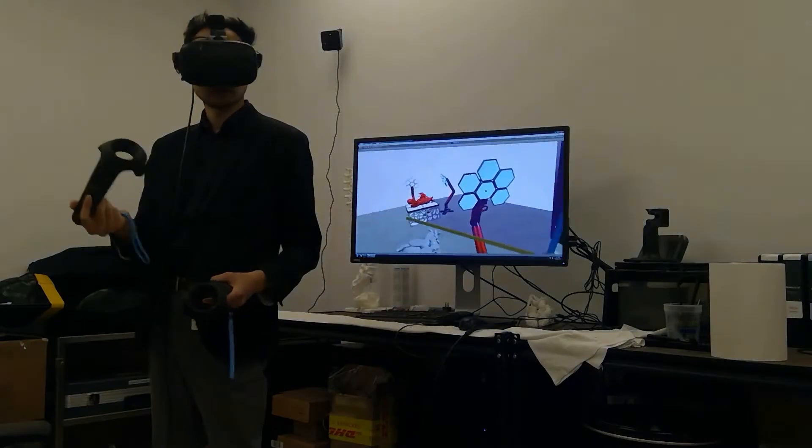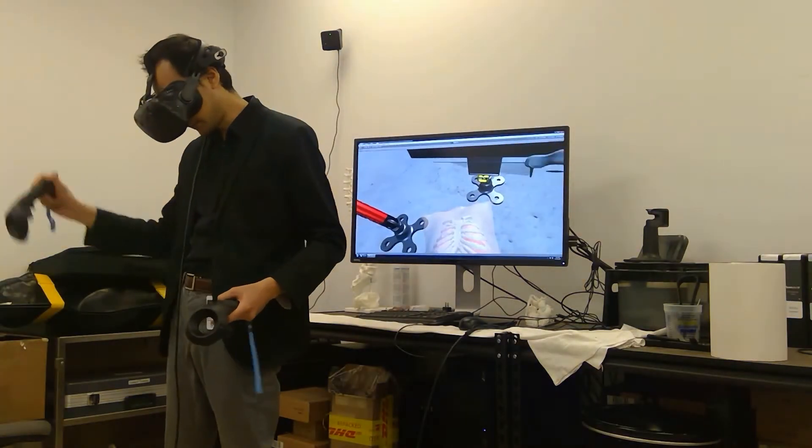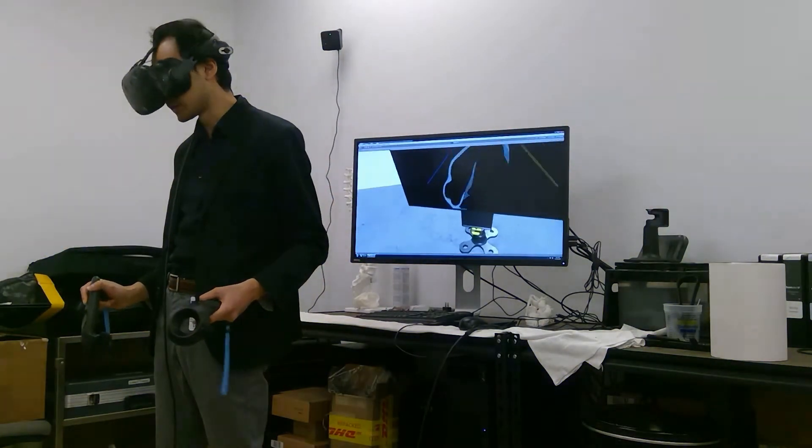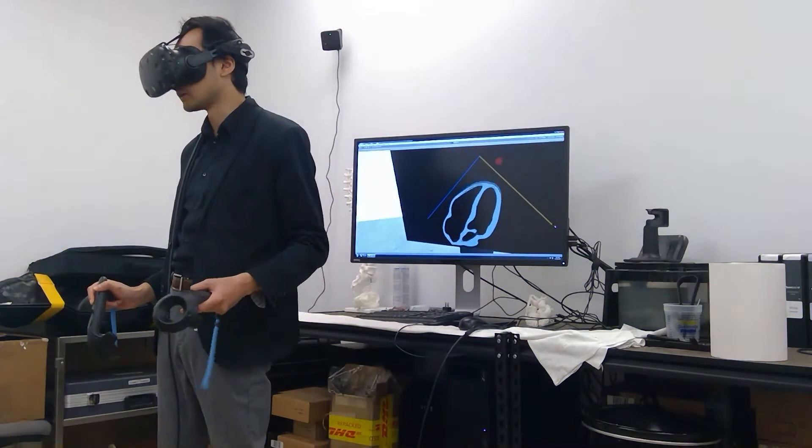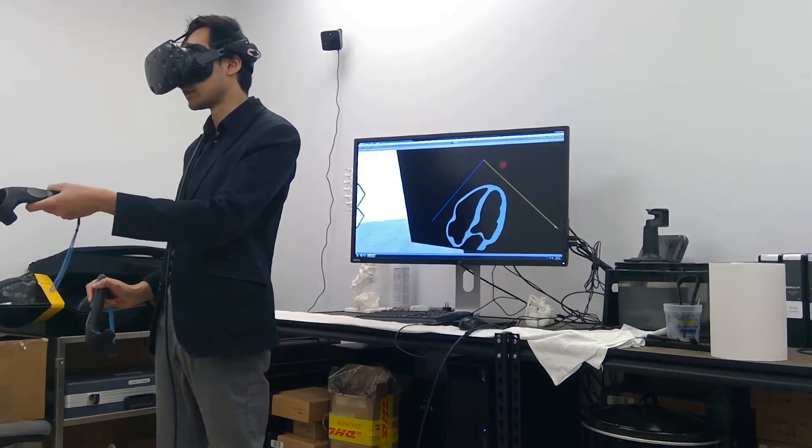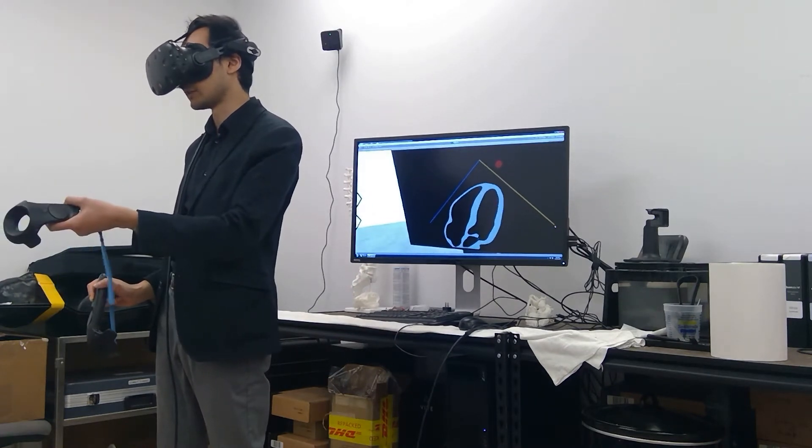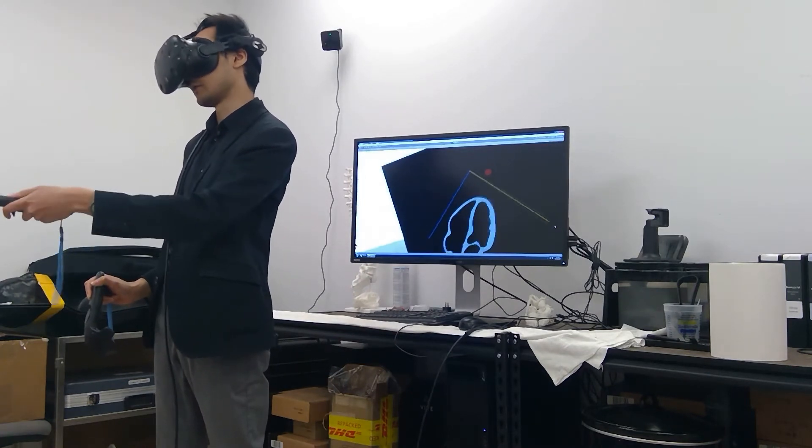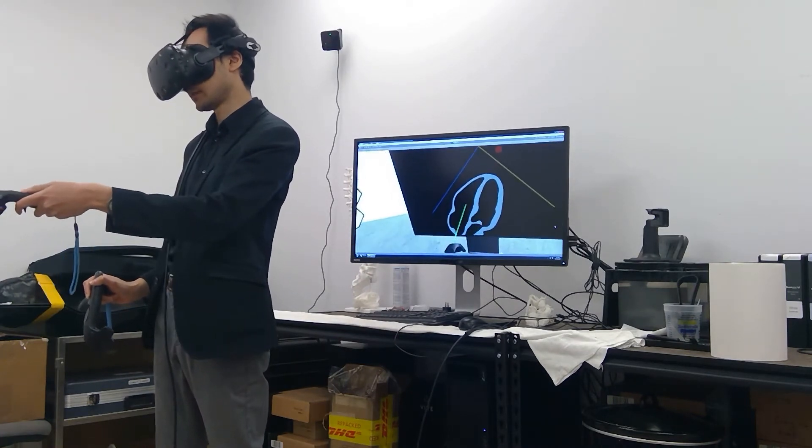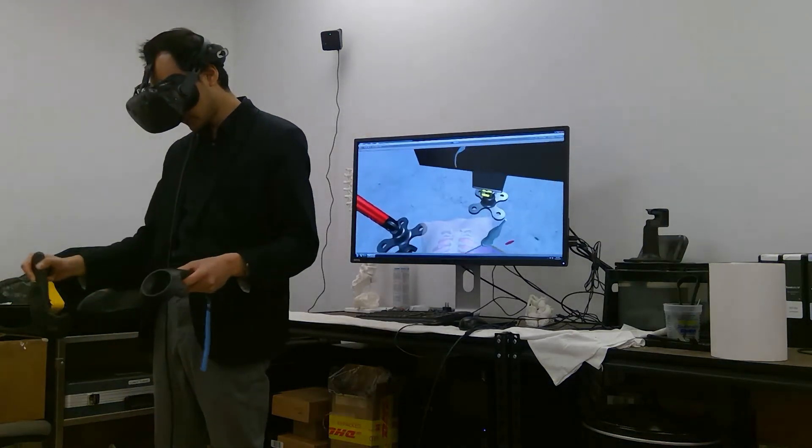So I can take the mock transthoracic probe in my right hand, apply it to the chest, and it will generate a real-time image of the heart as if we were looking at it from CT. So this is the apical four chamber, as you can see over there.